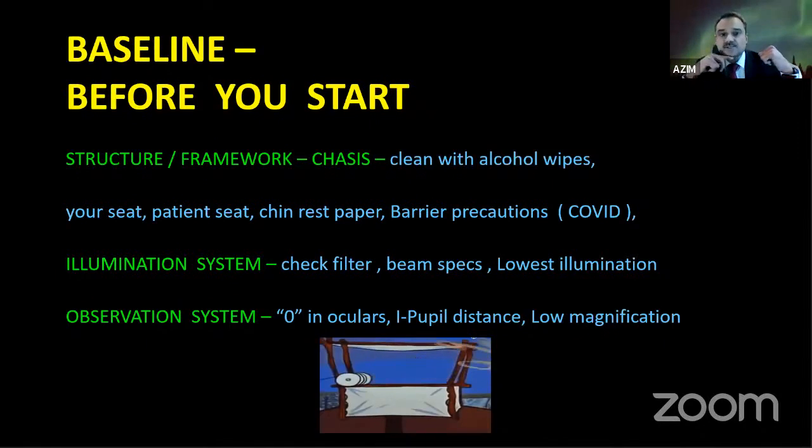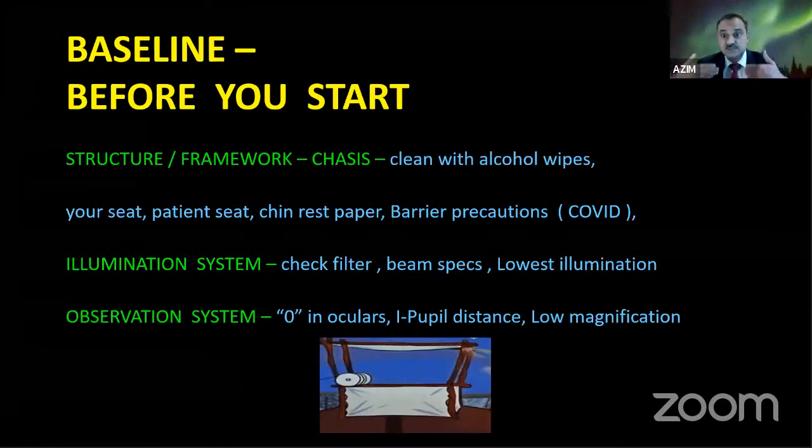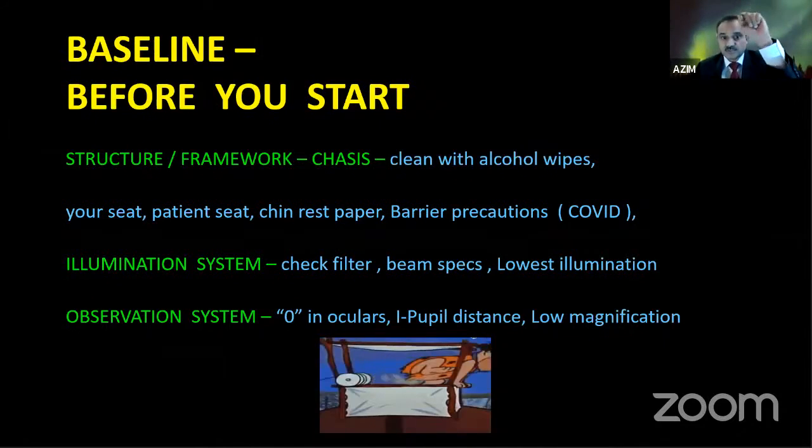Chin rest paper ideally should be changed between patients. Barrier precautions because of COVID. We have to use a barrier to make sure you're safe. That's very important. The illumination system, remember to check the filters, make sure it's not in the wrong filter.